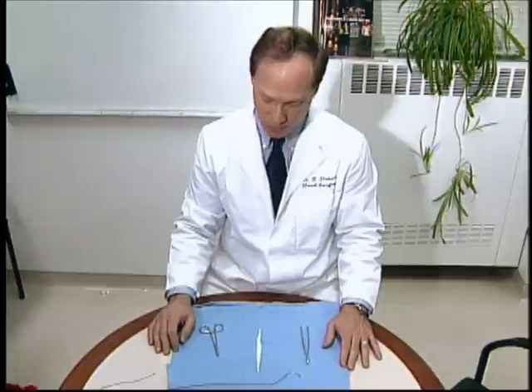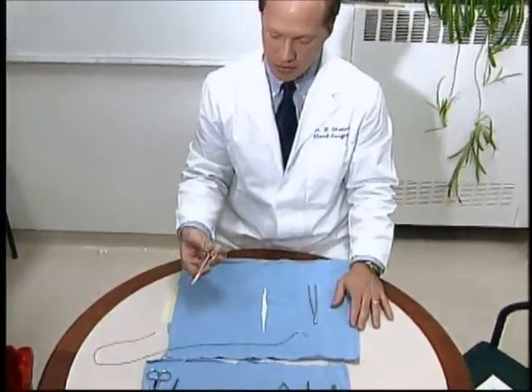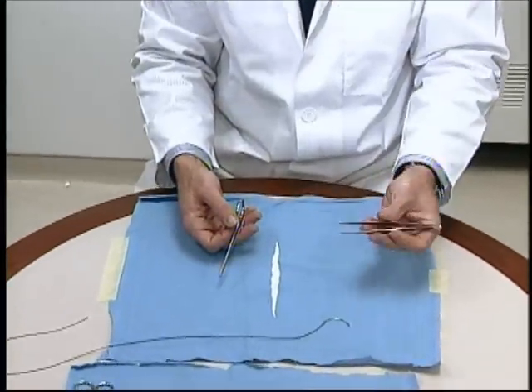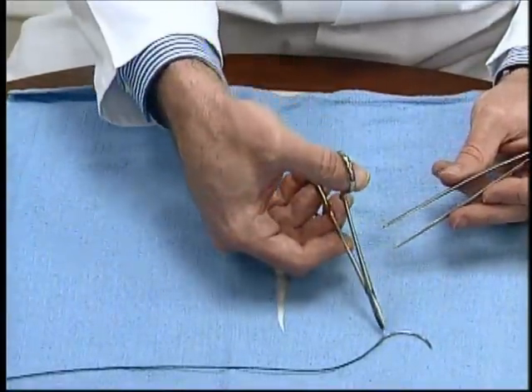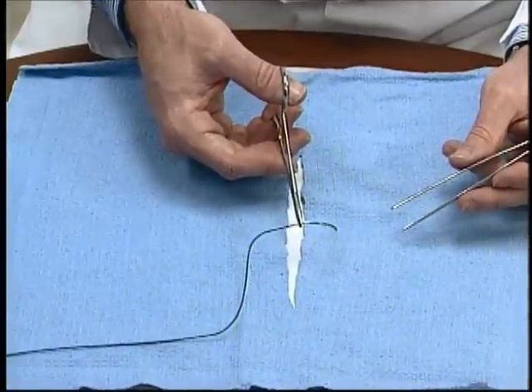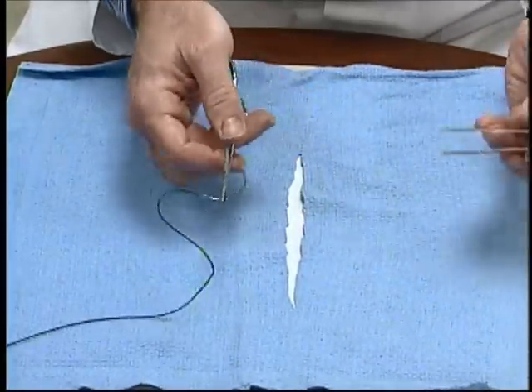Normally in the operating room for macrosurgery we use a standard ratcheting needle holder in the right hand, and in the left hand we have a forceps of varying natures. This is a large number two needle for demonstration purposes. Normally the needle is grasped about two-thirds of the way from the tip for maximum stability.